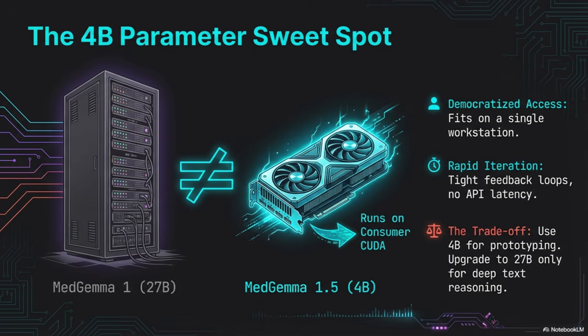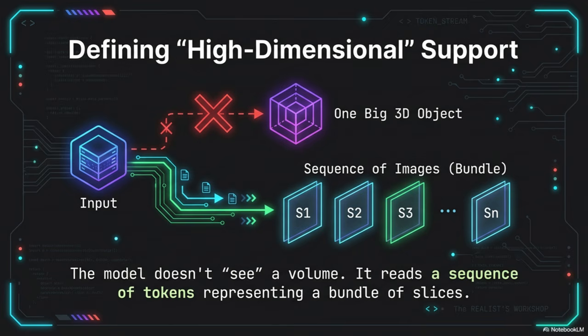We need to clarify what that high-dimensional support actually means in practice, because this is where developers often make the wrong assumptions. Yes. It does not mean the model ingests a DICOM file and just scrolls through it like a radiologist on their workstation. That's not how it works. So what's the right mental model to adopt here?